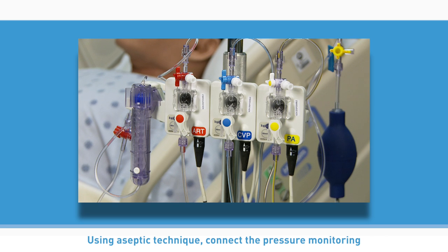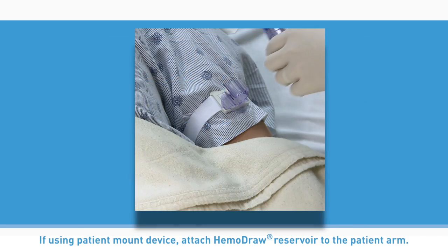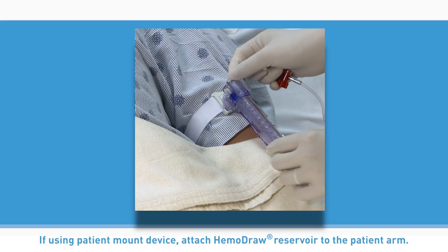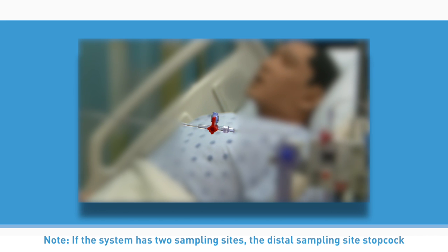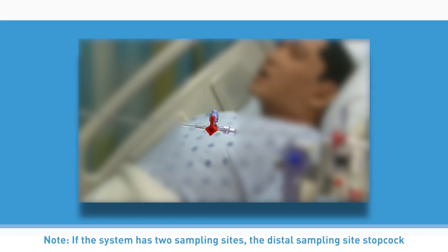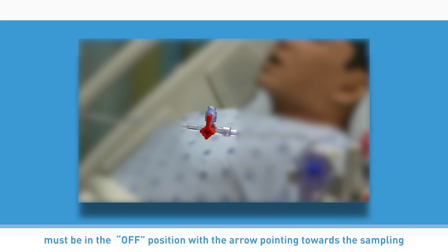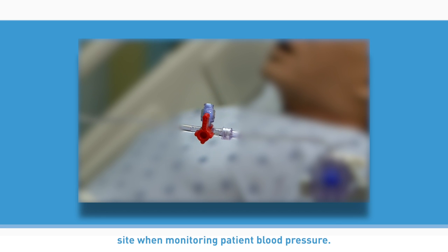Using aseptic technique, connect the pressure monitoring tubing to the patient's vascular access device. If using a patient mount device, attach the Hemodraw reservoir to the patient's arm. Note: if the system has two sampling sites, the distal sampling site stopcock must be in the off position with the arrow pointing towards the sampling site when monitoring patient blood pressure.